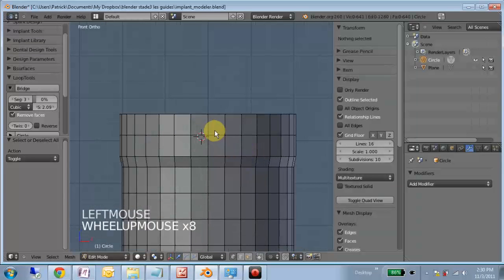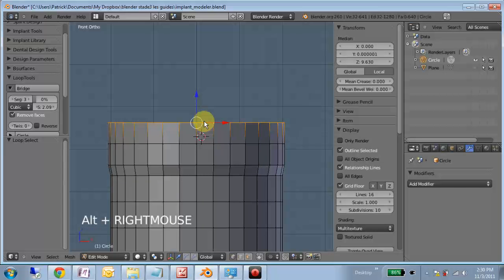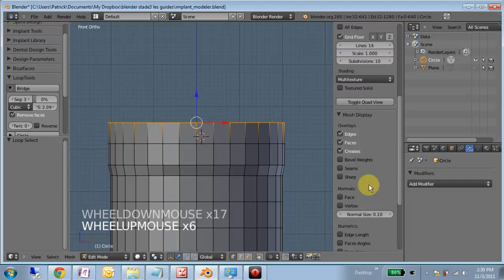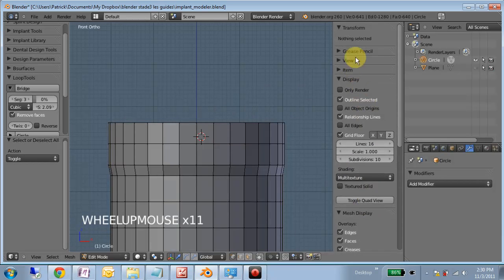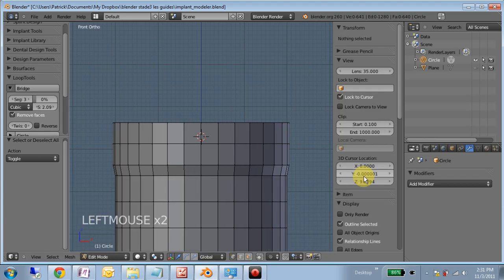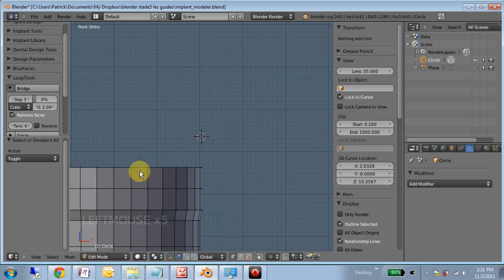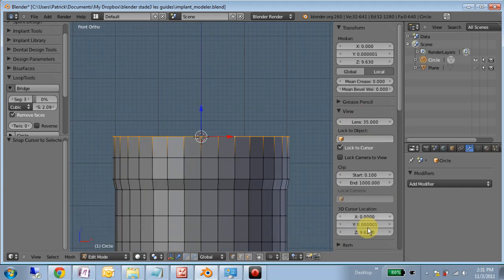So now I want to quickly make the external hex. I'm going to select the top layer here. I could also put the cursor location. If I deselect everything, I can place the cursor where I want manually. Alternatively, I can select all of these and Shift S, cursor to selected. It accomplishes the same thing, except it's a little less exact.